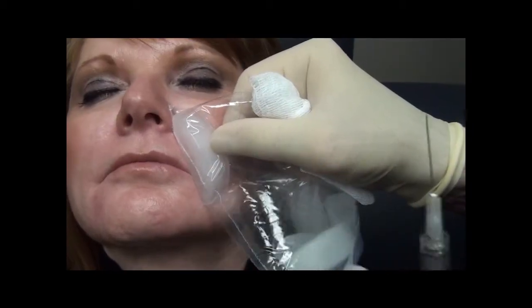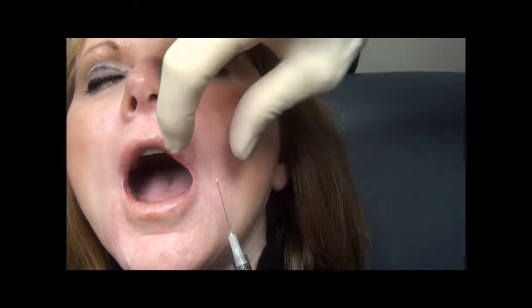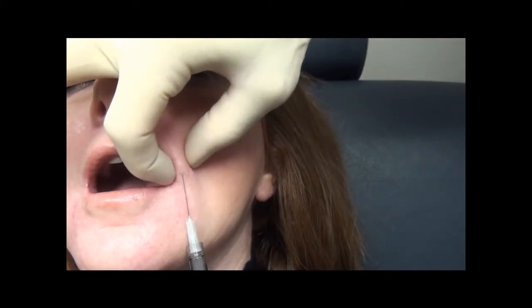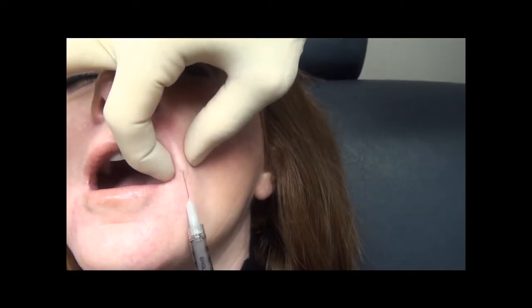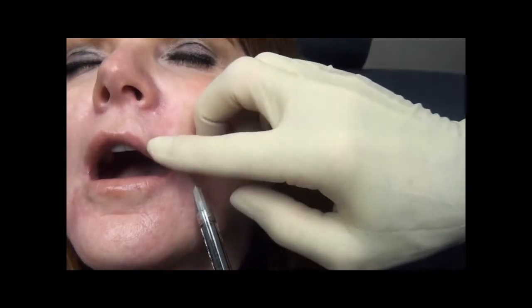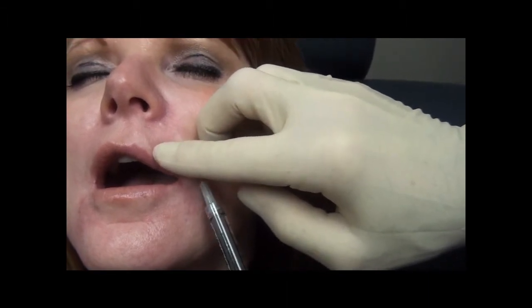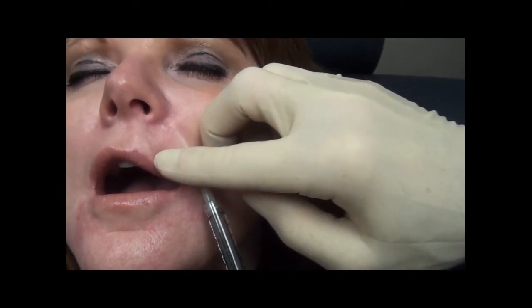We've iced the area prior to injection and now we'll begin the injection. Open your mouth real big for me, Julie. We're going to place the needle very superficially in the nasolabial fold wrinkle. You can see the outline of the needle as it's going in, and that is how you can determine that you're in the proper level for injection of L'Aviv.